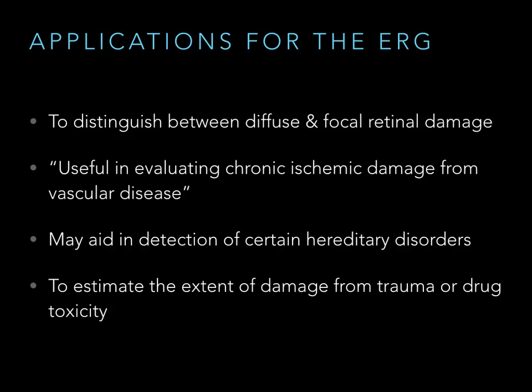I don't know of diseases where you get a good cone response and a bad 30 hertz flicker. I'm sure they're out there. You don't need to know that kind of detail either. I made it this far without it.